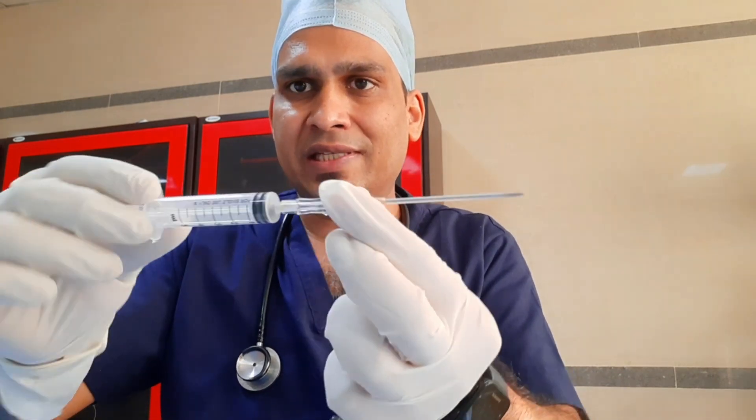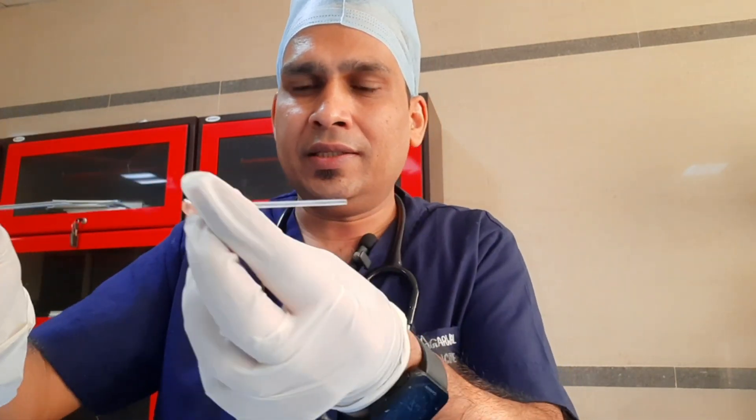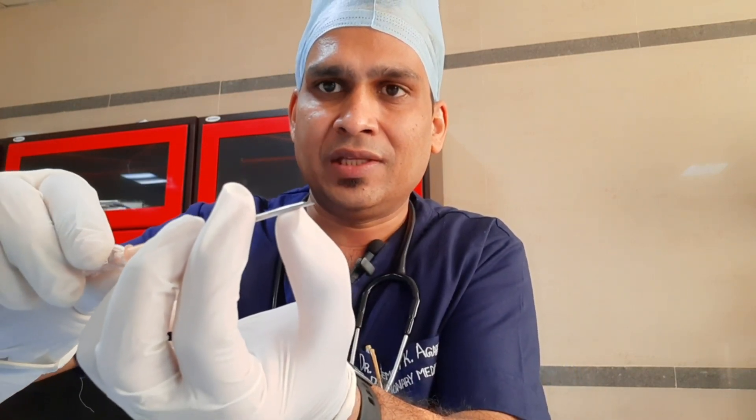We will open its set and see what is inside. This is the whole assembly. It has a syringe and this is a 14-gauge needle — can you see the 14-gauge needle? And this is the sheath, so the needle goes inside the sheath and just the tip is coming out. Can you see this needle tip coming out from the sheath? This whole assembly will pierce the intertracheal space.